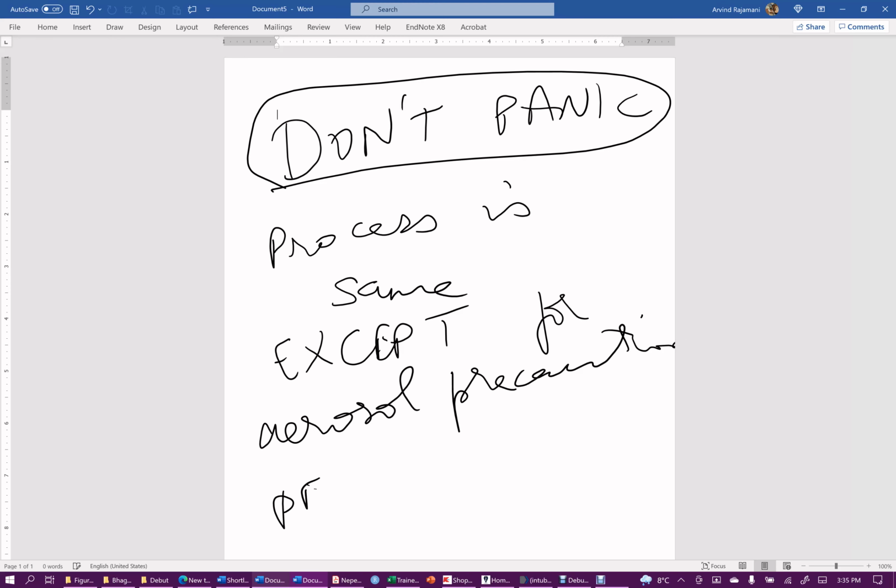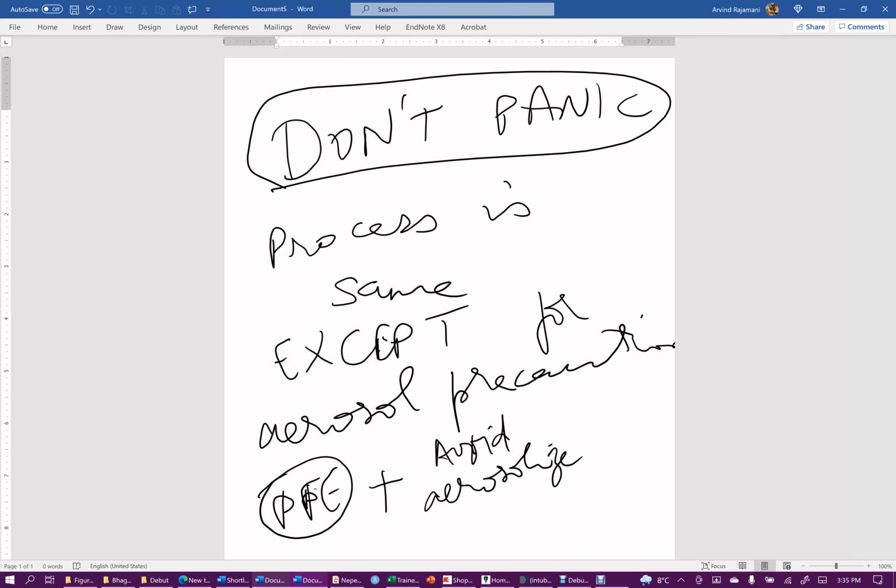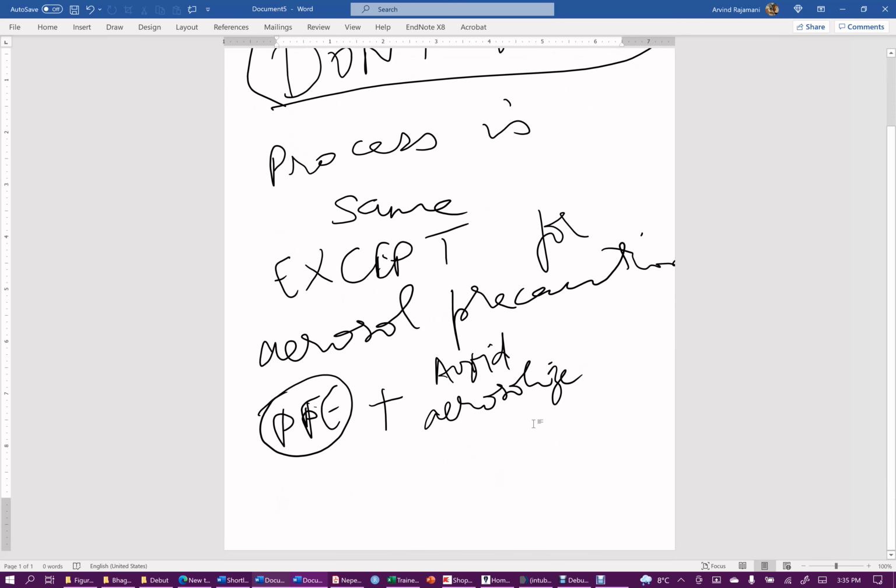So don PPE, and avoid things that aerosolize, such as bag valve mask ventilation or very high flow of more than 50 liters, etc. Having said that, I would not have a problem rescuing someone's oxygenation with a few breaths of double-handed mask ventilation. I would prefer to do that than risk ongoing desaturation, cardiac arrest, and a front of neck surgical access. I wouldn't want to do that. But that's just my bias.